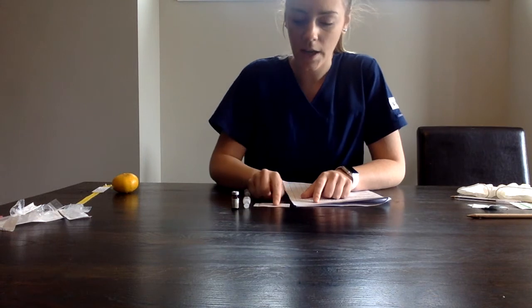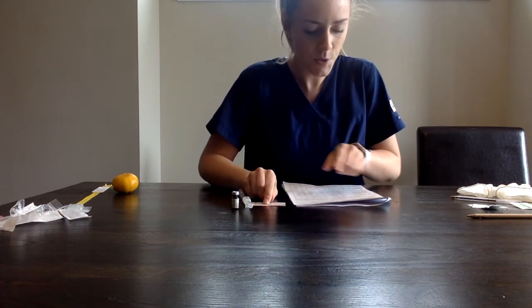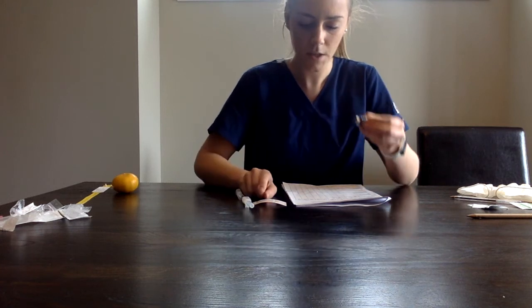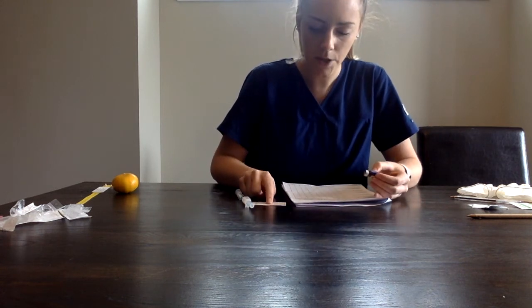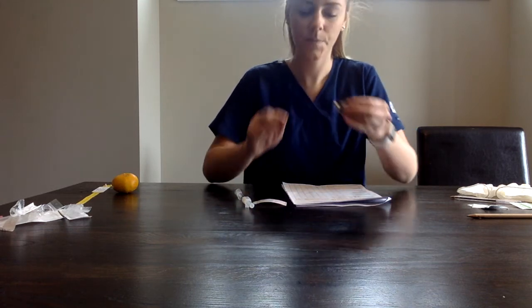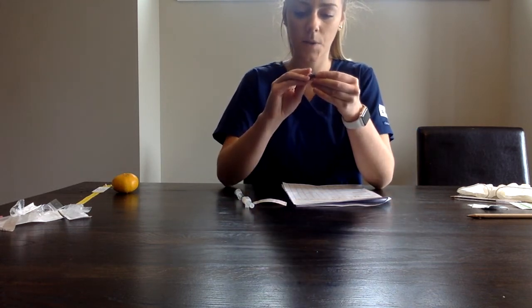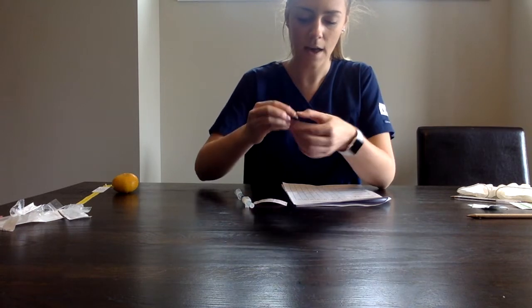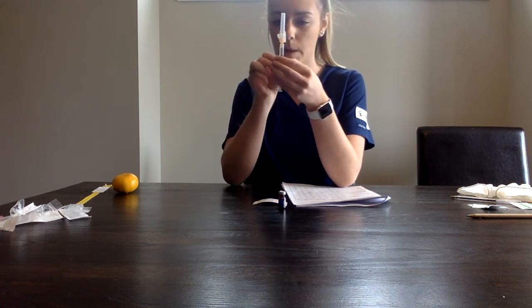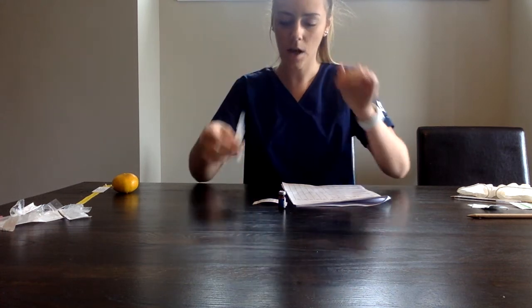So we have nursing Jake, hydromorphone, and on the vial we have hydromorphone. 2 milligrams is our dose. The concentration is 2 milligrams per ml, and on the vial it says 2 milligrams per ml. Our volume we have drawn up in our needle and syringe is 1 ml. So I'm verifying we have 1 ml, no bubbles, and we have a bleb at the top.